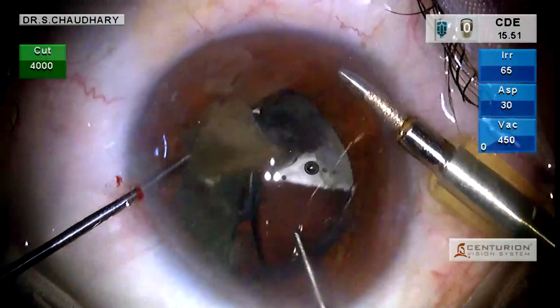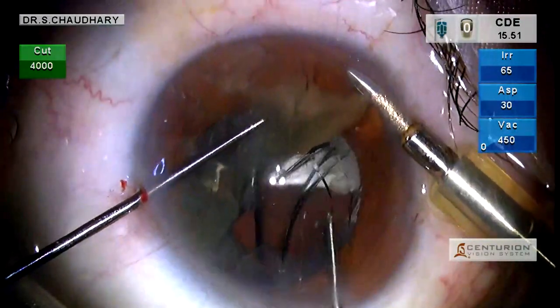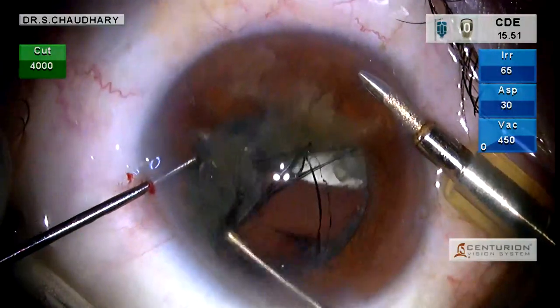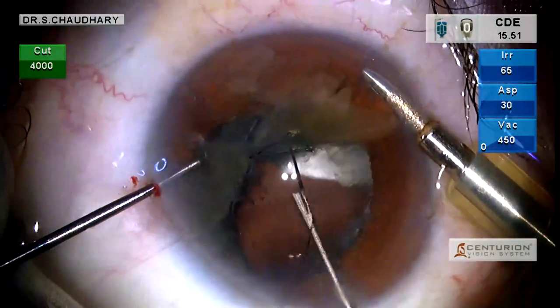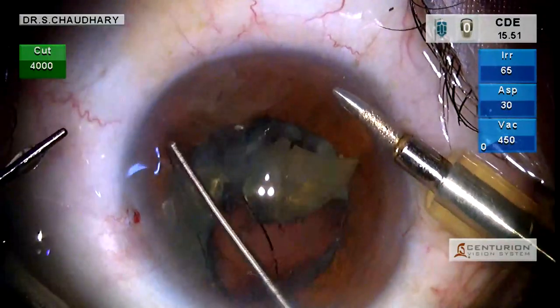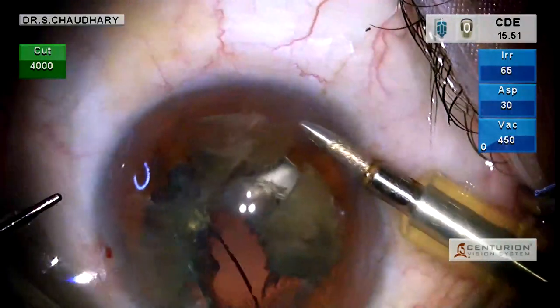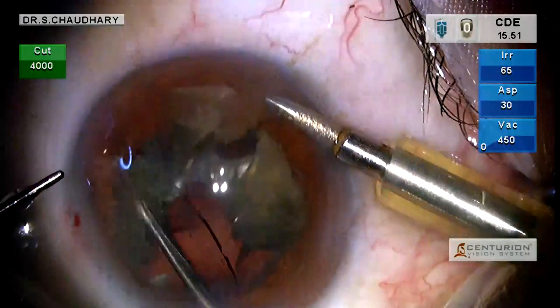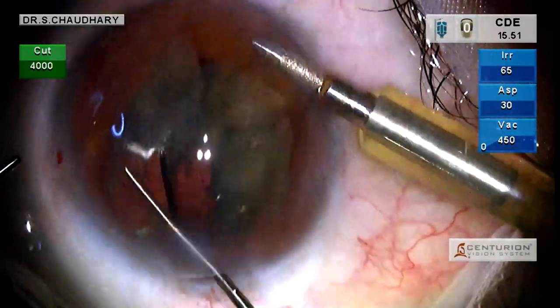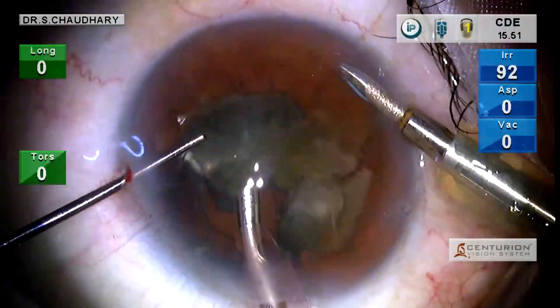The bandage contact lens is injected into the eye and we open it up over the iris. In the process, we guide the nuclear pieces into the concavity of the bandage contact lens. Now the bandage contact lens is fully open and is working as a scaffold.